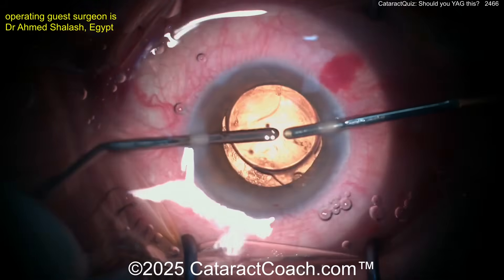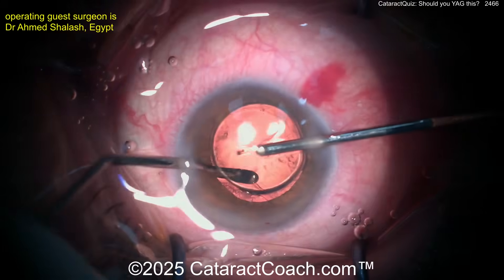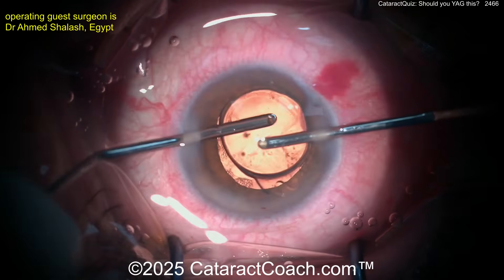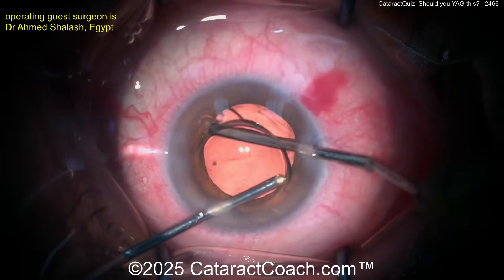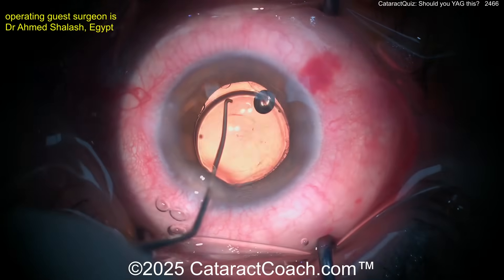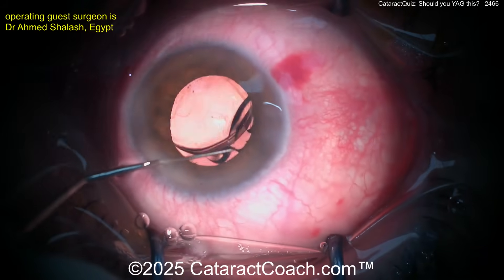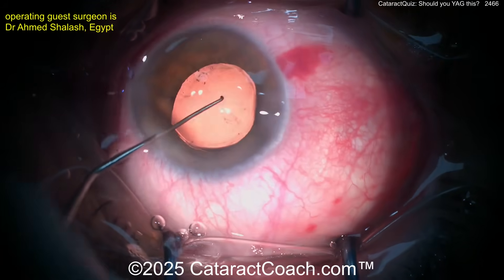The patient is obviously going to be very happy — you're cleaning up all that lens material. Could it come back in the future? Sure it could, but this kind of thorough cleanup is very helpful. Don't grab the capsule there. Very nice cleanup — look how clean the capsular bag is now. There's really no fibrosis of the capsular bag. Now putting the IOL back in the bag under the guidance and protection of viscoelastic, getting the haptics in good position.